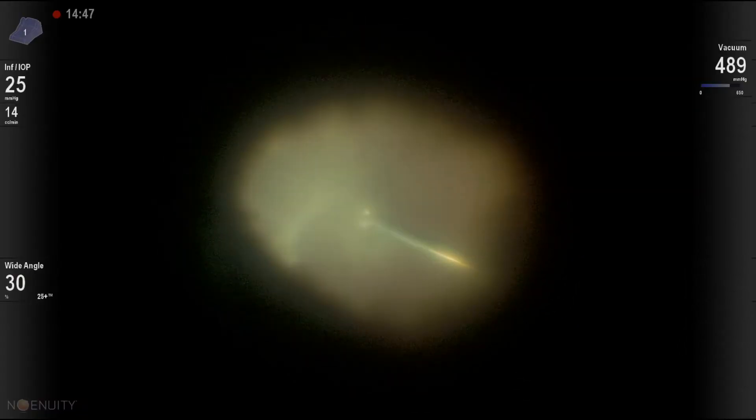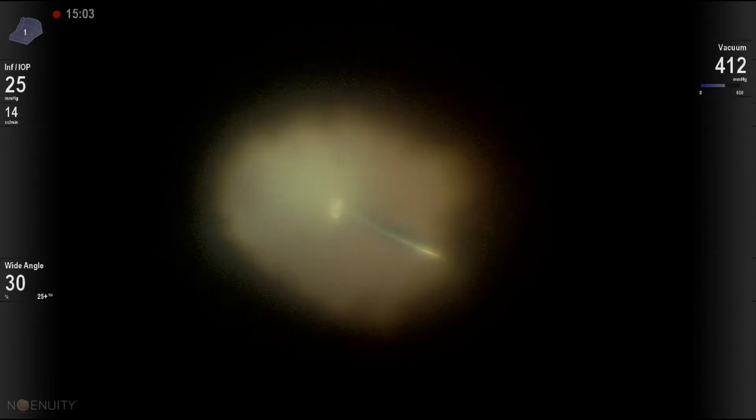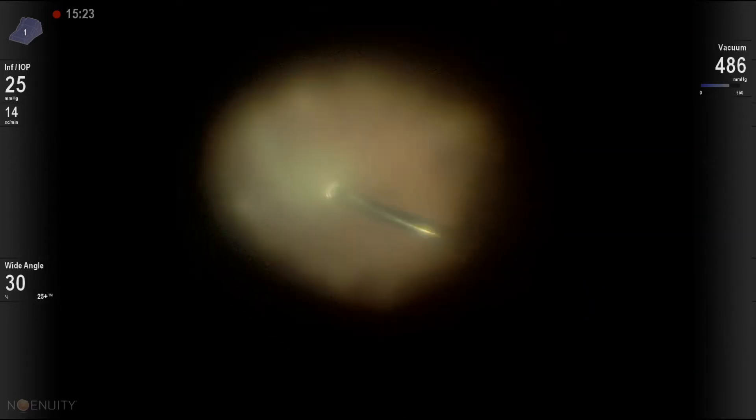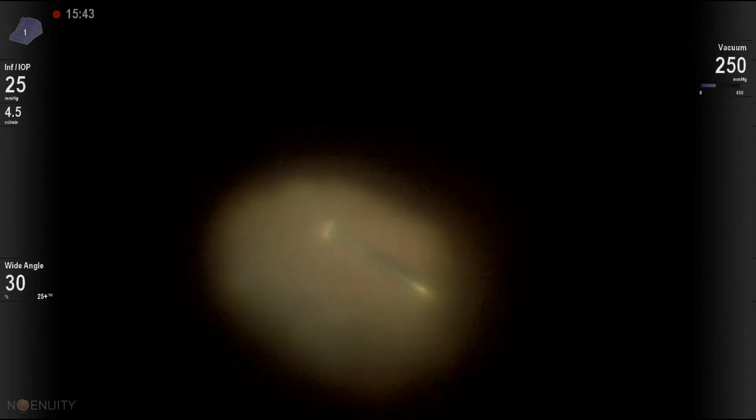Now the pars plana vitrectomy continues — the patient has been vitrectomized before, so we're just staying in the mid-vitreous cavity, clearing the vitreous opacities. One needs to be cautious at this stage because the view is not very good, but we're starting to see the retina here.